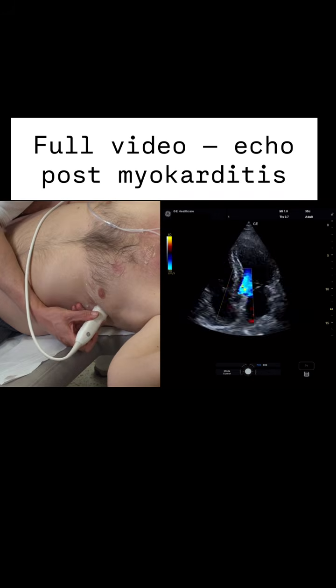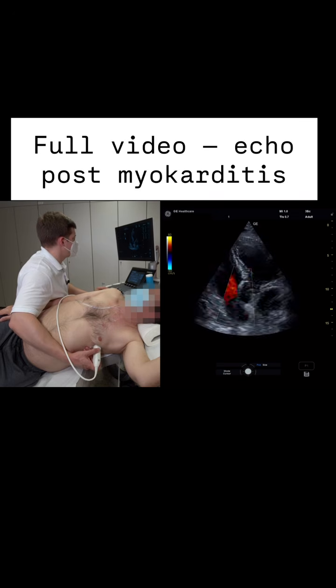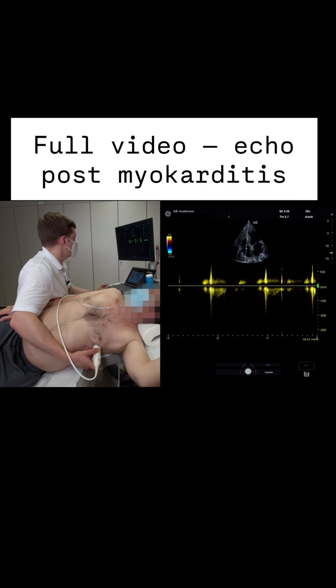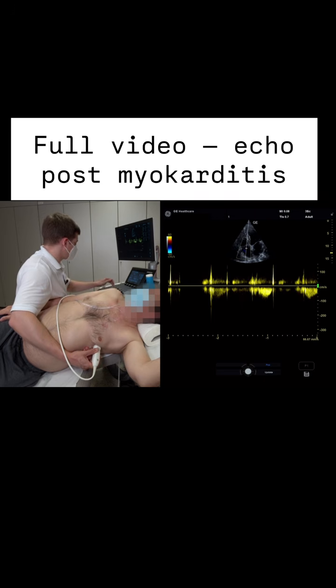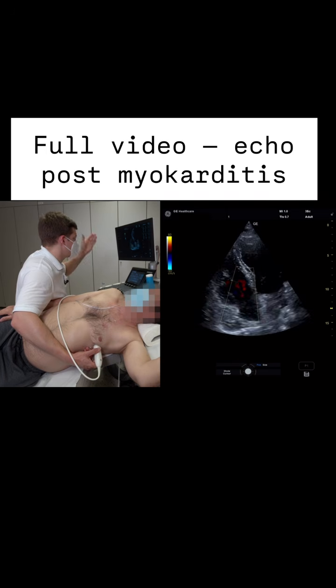Now let's continue with the right ventricle. With the right ventricle, we saw a TR, we graded it as not really significant, but we do want to measure the systolic pulmonary arterial pressure. How can we do that? We have to find the optimal view of the TR signal, and we simply have to adjust the color Doppler so that the continuous wave Doppler really identifies where we have this turbulent jet flow.